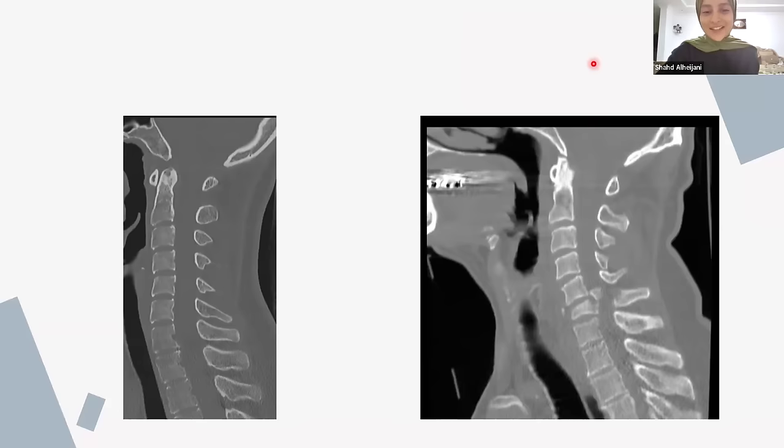Fracture, yes, exactly. So here we have a cervical spine fracture. So this is the cervical spine. This is, I think, at C6. 1, 2, 3, 4, 5, 6. So this is C6. Here you have a fracture in the cervical spine. You can see it's broken from the vertebra. And here is the normal patient. So here the broken bits will be the fracture.